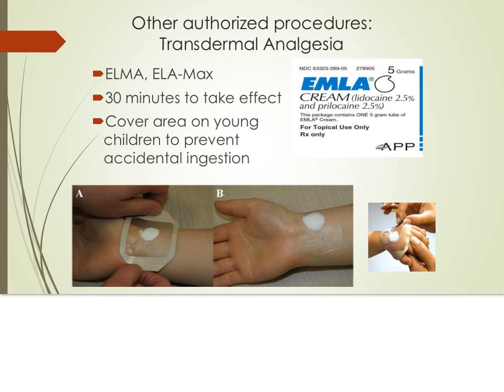Finally, depending on facility preference, topical analgesic creams and patches may be used prior to venipuncture as long as there is a physician's order and a policy. Although transdermal creams are effective, the disadvantage is the time duration until an anesthetic effect can be up to an hour. Make sure to assess for allergies to lidocaine prior to administering the cream.